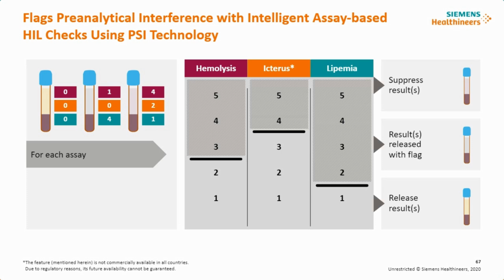Or again, depending on the comfort level of the laboratory and the medical director, you could release those results with a flag. Again, highly dependent on the laboratory itself.